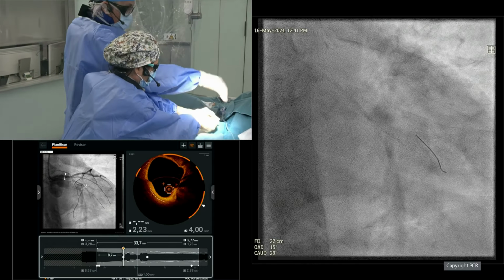Okay, so Nieves, this is a good place where we can test the rotation of the wire. The wire is still not out. I will wait until you get the wire out. Yeah, now. Okay, you got it? You want to hold it? Hold the wire with the brake? Yes. Okay, and then we can try that. Go? Yep.